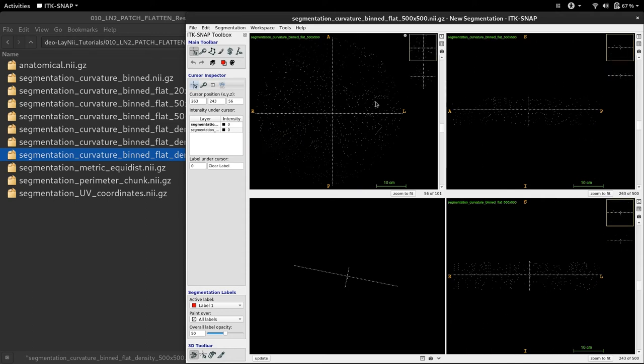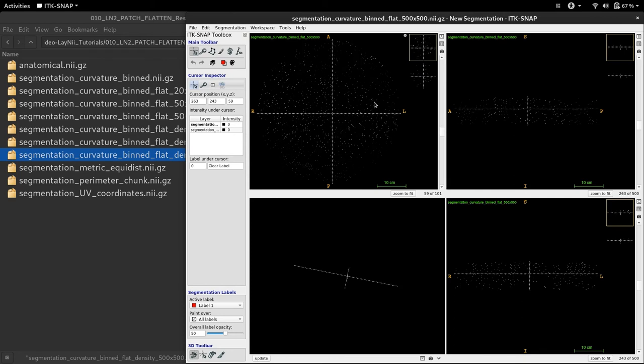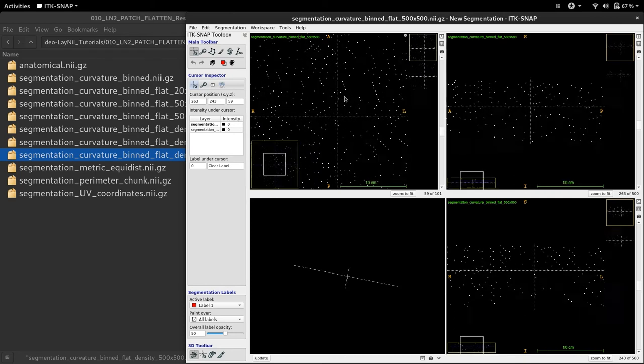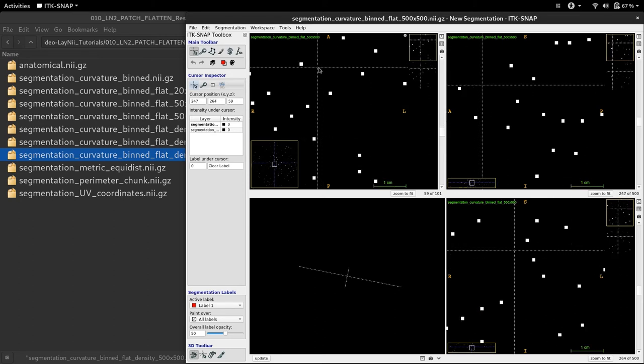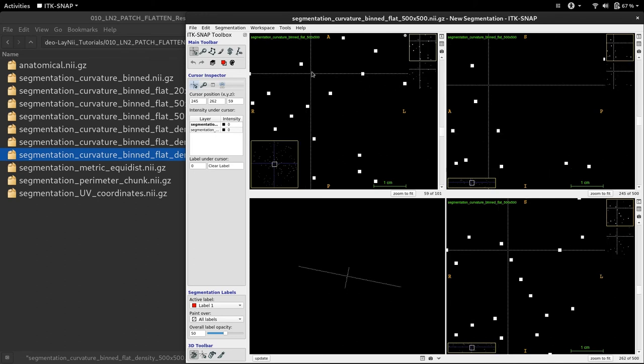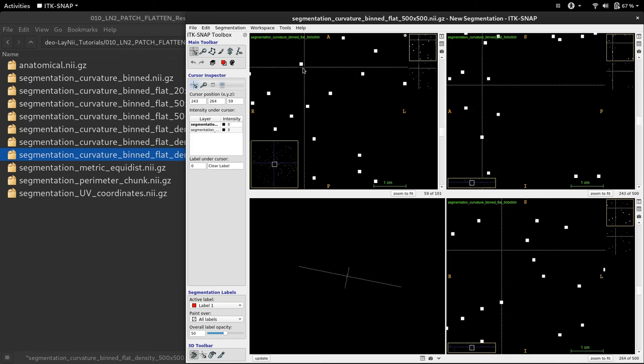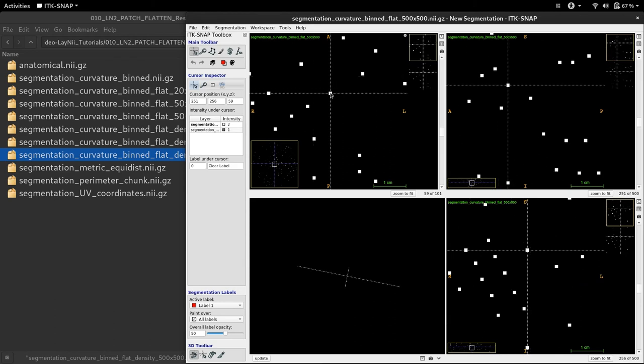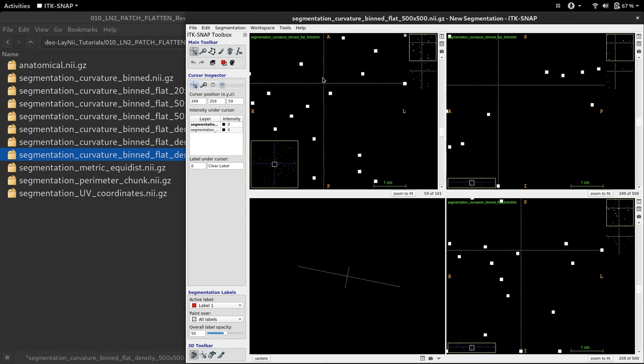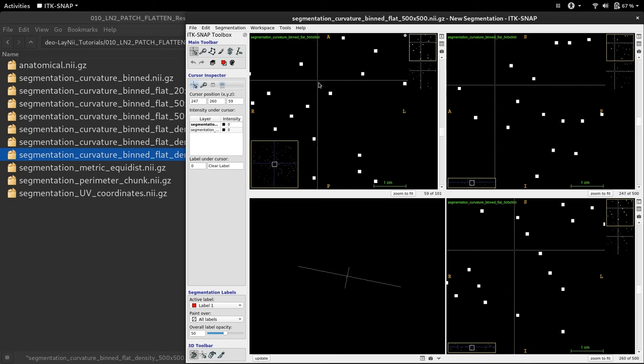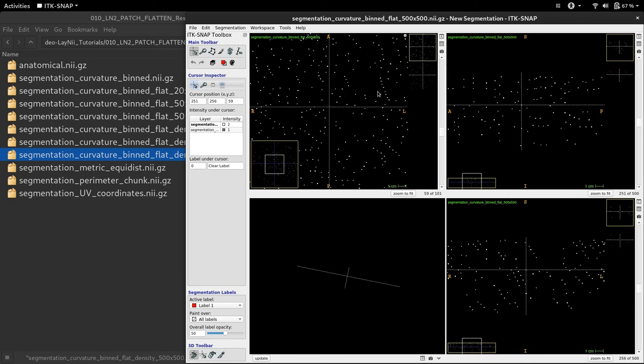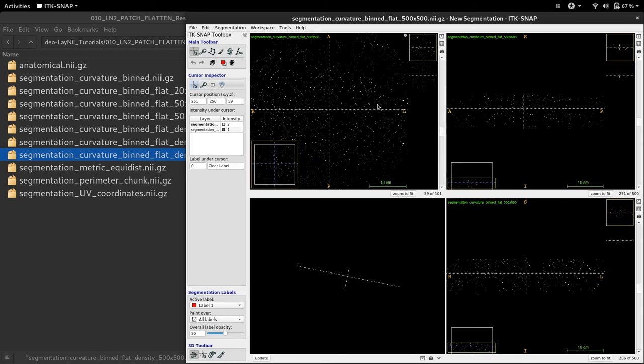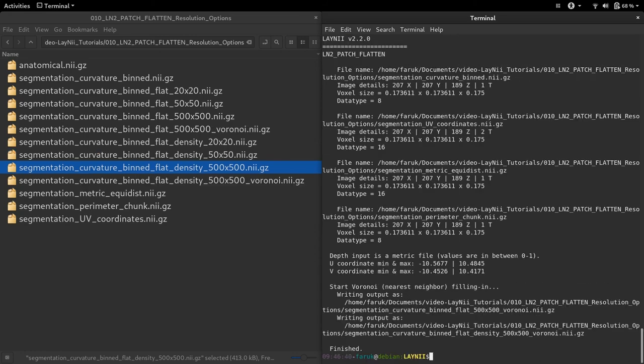Some of you might think that this can be a problem. However, we can solve the sparsity problem easily by using a simple interpolation method. For instance, for each black voxel in this flat representation, we can use nearest neighbor interpolation, so that whichever is the nearest voxel to this empty voxel will inherit the value of the filled-in voxel. This simple interpolation method is implemented in ln2 patch flatten. All you need to do is add an extra parameter called Voronoi. Now let's run it and see what will happen.